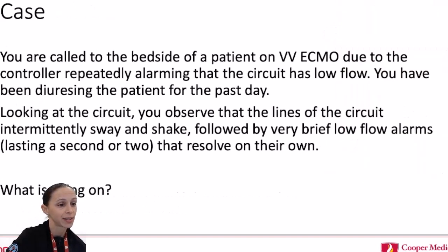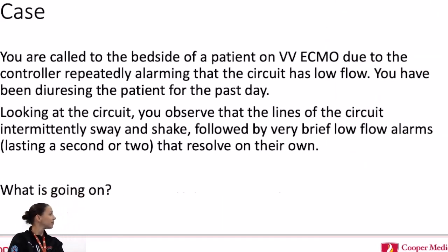All right, more scenarios. Can I just make a comment about that? We talked about this before because nurses, we like to mark things on entry where the cannula enters the body. But because these people may be cannulated for a long time, they lose weight or they're fluid overloaded and we diurese them, and then the marking of the cannula isn't accurate. So we did a competency on this like 2 years ago: you look for your color change in your catheters, you look at your flow, you look at your SAT, and probably need to call for X-ray. It's an emergent situation where you want to call your ECMO physician right away if you notice anything like that happening.